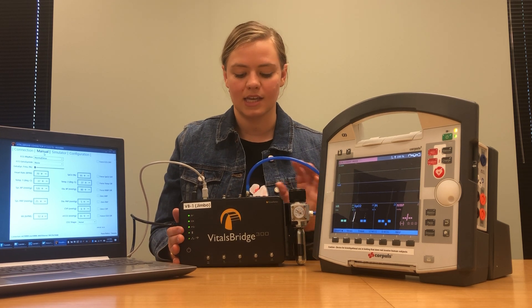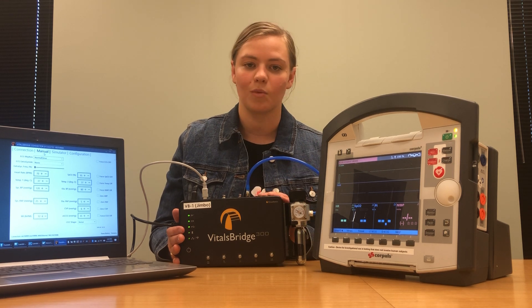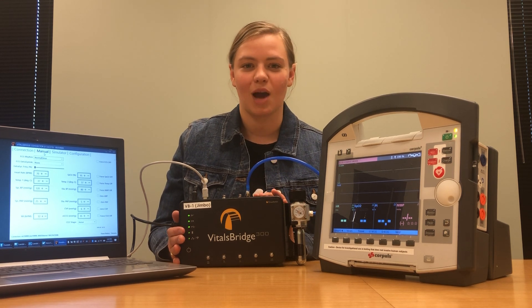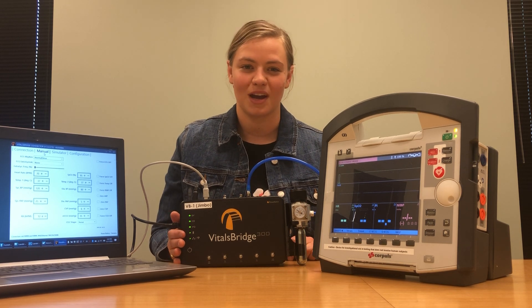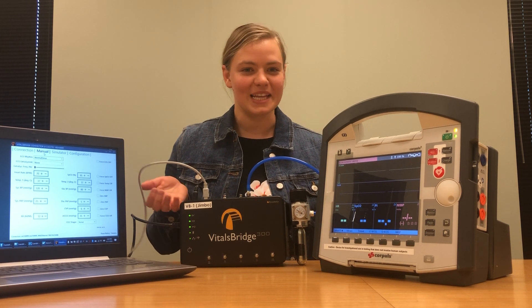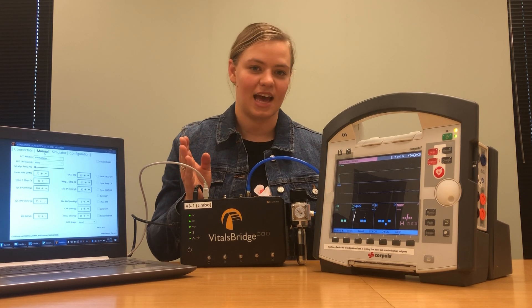You're welcome to connect any carbon dioxide source you have — a wall tank or whatever it may be — but just make sure you talk with your facilities manager before connecting it so that everything has the correct pressures. All right, let's begin. Since we already started talking about carbon dioxide, let's connect that cable first.